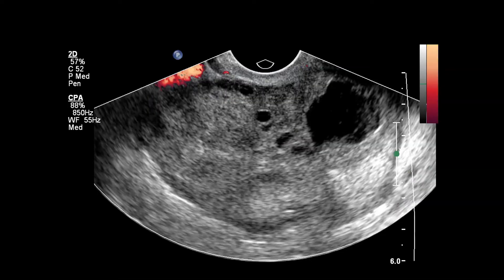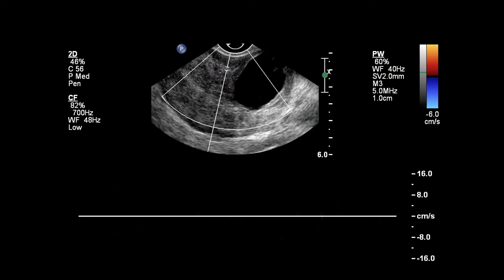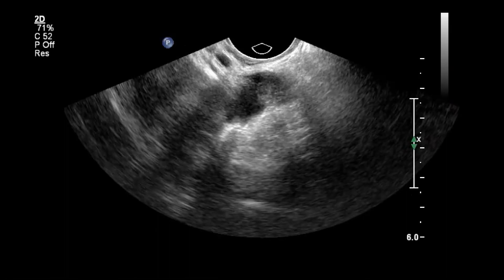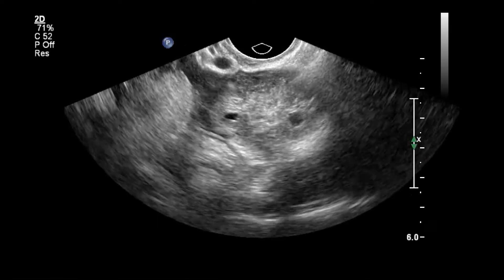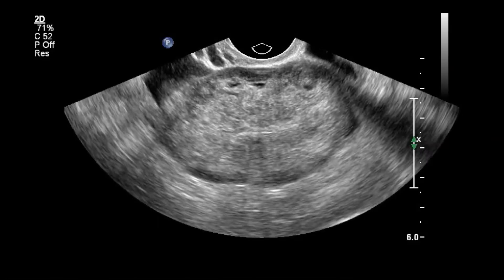We don't see any flow on the power Doppler images of the ovary. When we evaluate with spectral Doppler, we don't get any waveforms — arterial or venous.